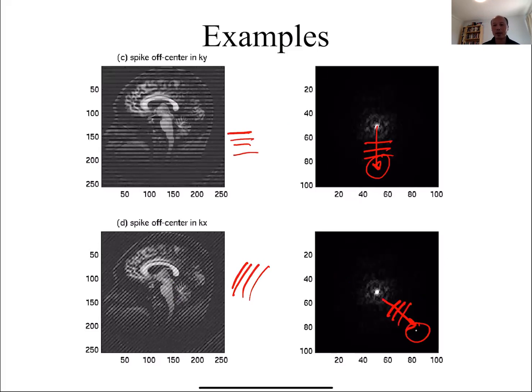You do see these once in a while in MRI. Sometimes there might be interference, either from an external source or even just metal hitting itself with vibrations. These can cause a little bit of energy to get into the coils, and that energy can end up any place in k-space. Depending on where it ends up, that's going to give you these stripes. So these are called corduroy or zebra artifacts in MRI.